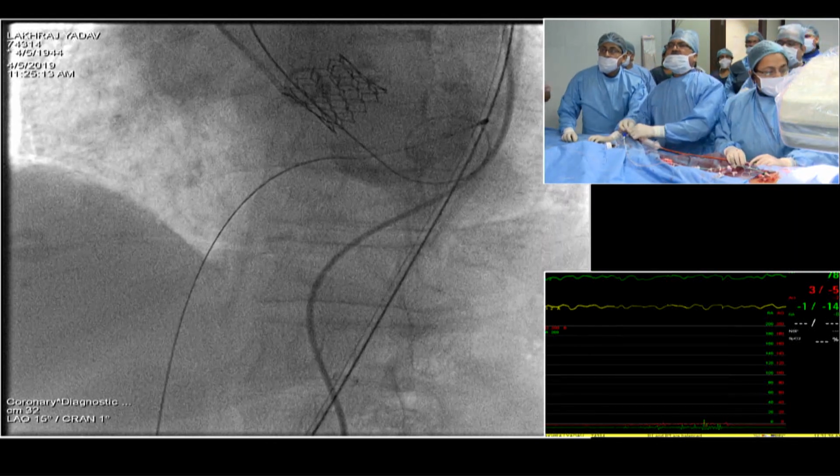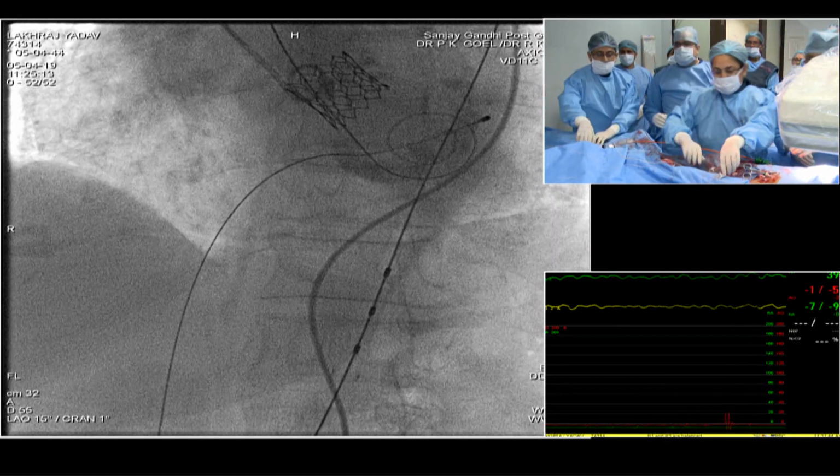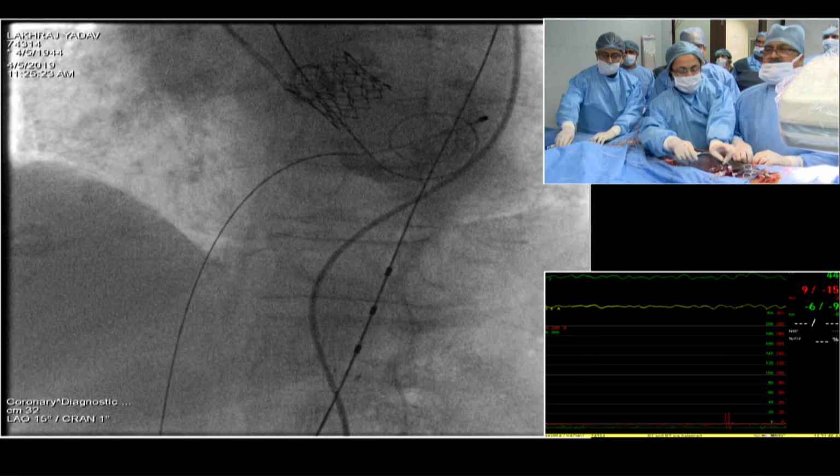Yeah, that's fine. Wait. Pressure. No, there's pressure. Show the pressure. Keep the wire, pressure. Yeah, I think you go offline and do some cardiac assistance. Get it offline, please.